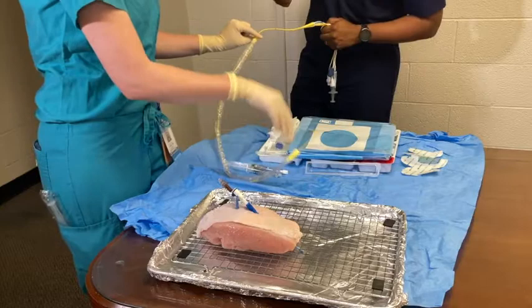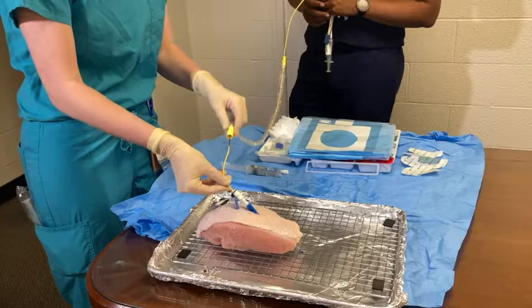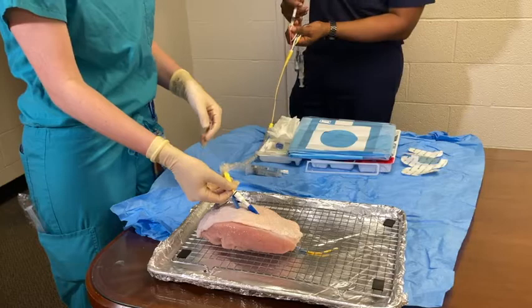Pull the sheath back to the 80 cm mark and lock into place. With the balloon down, insert the catheter with the curve facing to the left into the middle of the MAC introducer. Push in until the metal coils are covered. Once the metal coils are in place, your attending will inflate the balloon.